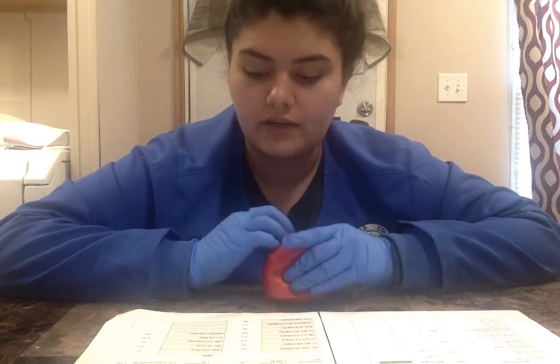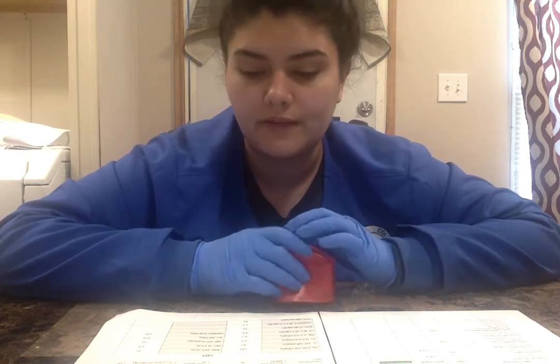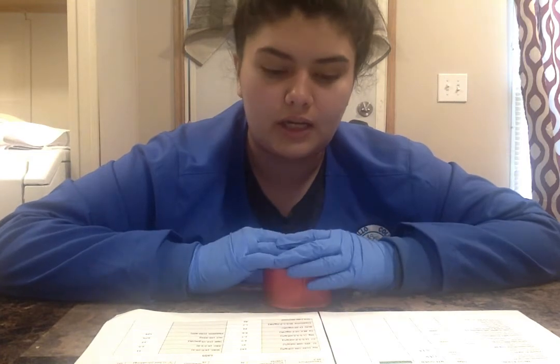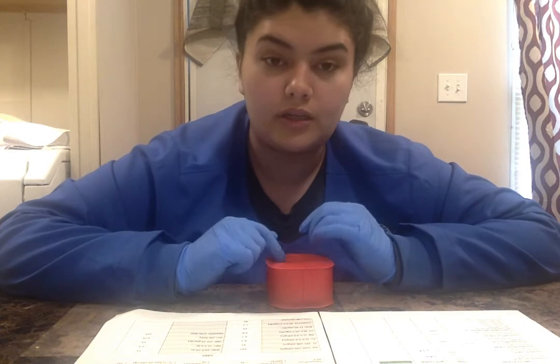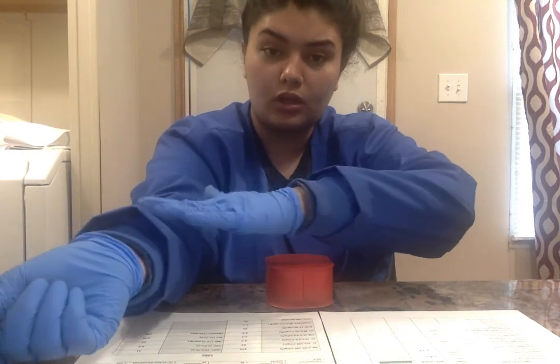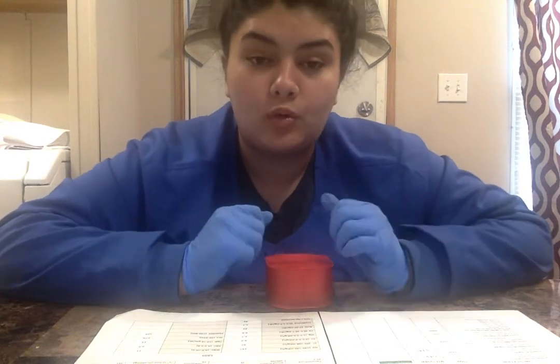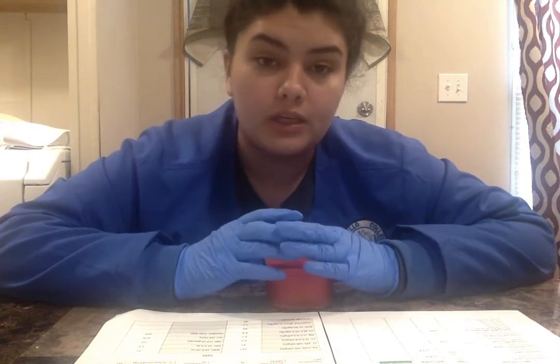And also, I looked at your white blood cell count earlier, and it is increased. It's sitting at an 11 on a scale of 4.5 to 10.1, which usually means that there could possibly be an infection. Also, being a diabetic puts you at higher risk for developing tuberculosis. So this is going into your forearm, underneath your skin. A wheal or bulb will pop up, and that's just the medication. That's just how this works.